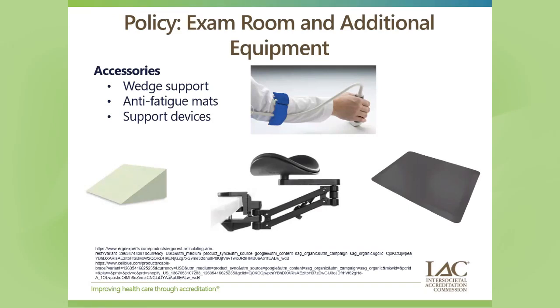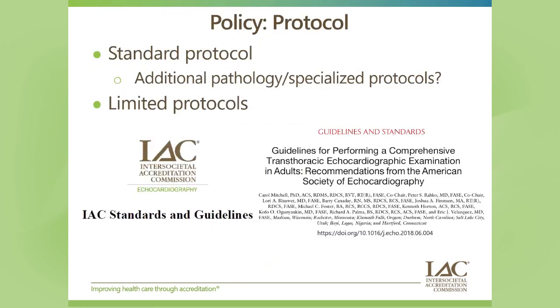And these are all things that are easy to clean. You can see in this example in the middle that there's a support device that you could include for your arm for support, and that could attach to your bed, or another device to help you out with that. And I know one of my sonographers likes to use this with the cable, and I think people have different opinions on that, but that is another supportive mechanism that takes pressure off of the body and transfers it somewhere else. So let's get into protocols.